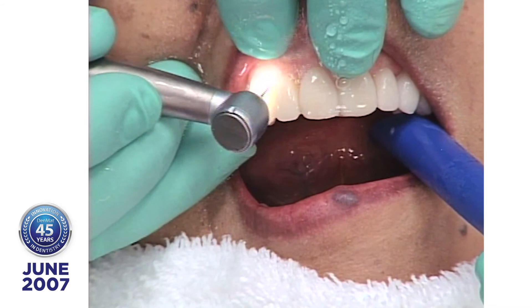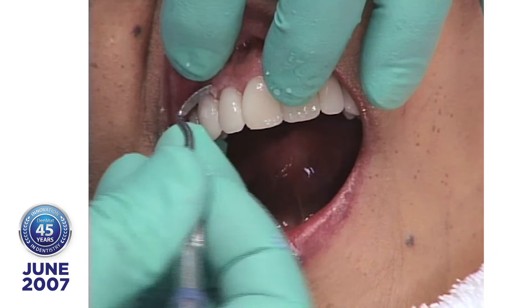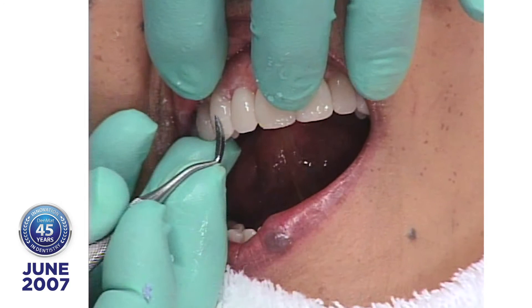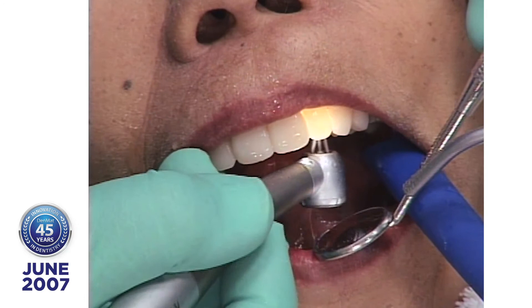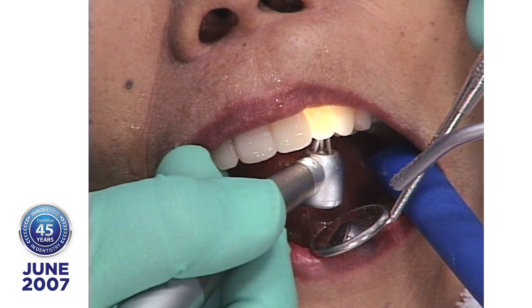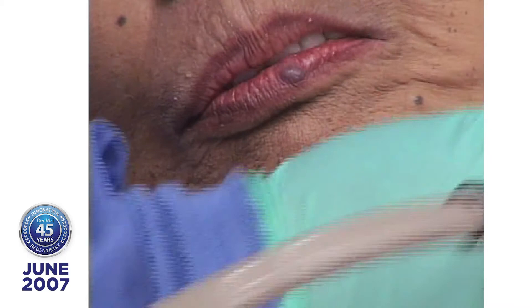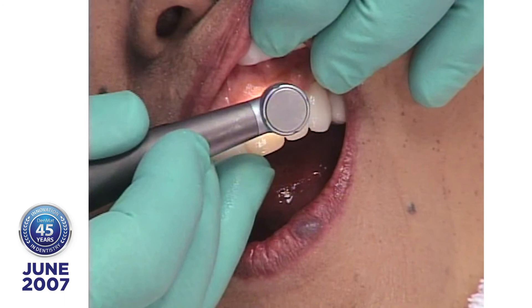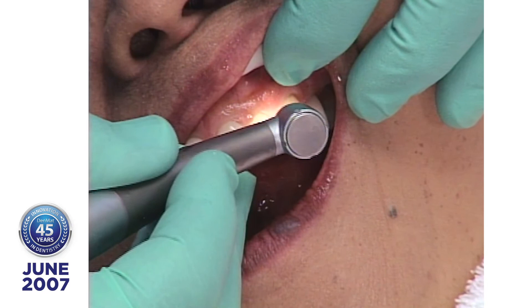I shave away any Ultrabond that's on the labial surface. Never work with porcelain unless you've got copious amounts of water — you'll build up heat, cause micro cracks, and get all kinds of trouble. I'm just opening these embrasures so that when I take the Seri Saw to open the embrasure, it won't be difficult to open these contacts. When you run your explorer along the gingival margin you should be able to go from the labial anywhere, up and down, and not have a catch. If you don't like the emergence profile, you just come back and do a little contouring the way you'd like to have it — so you're in control.